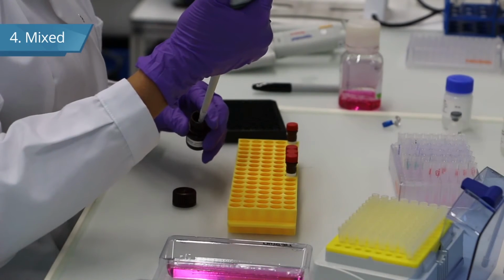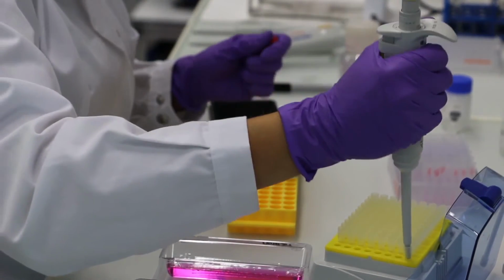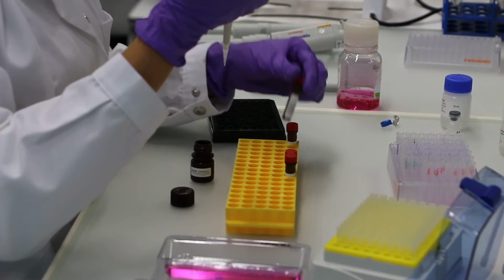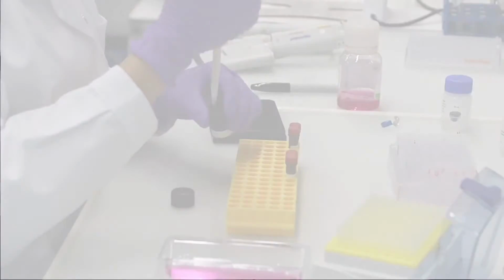A bead cocktail is produced in order to capture all of the proteins of interest. Up to 50 beads can be mixed together to identify and measure 50 different proteins in a given sample. Typically, we mix up to 12 beads in a given experiment.